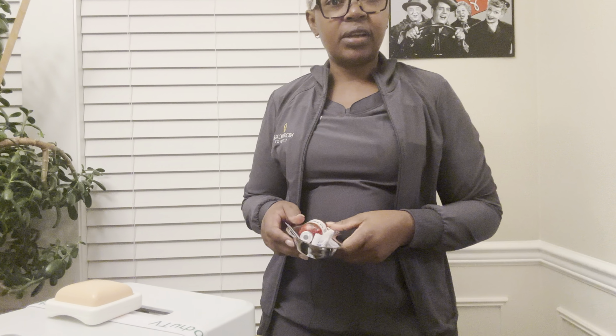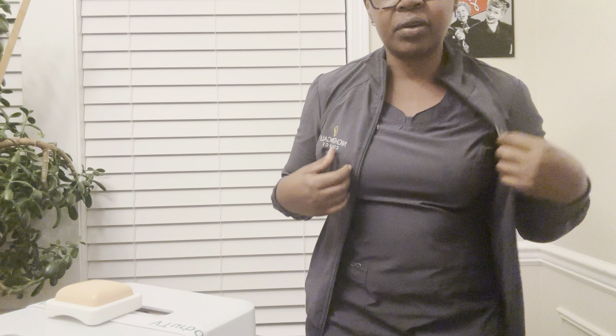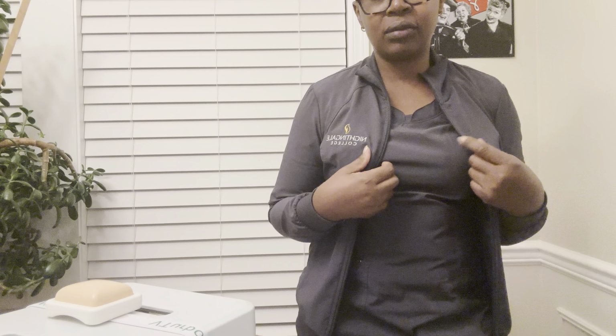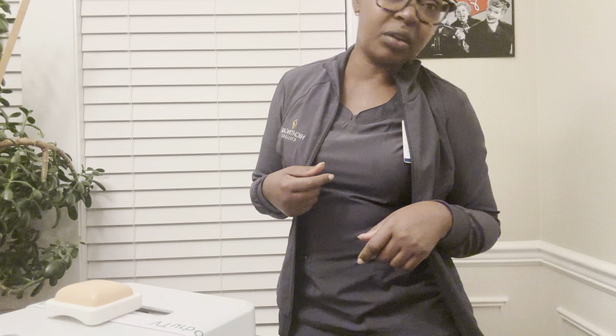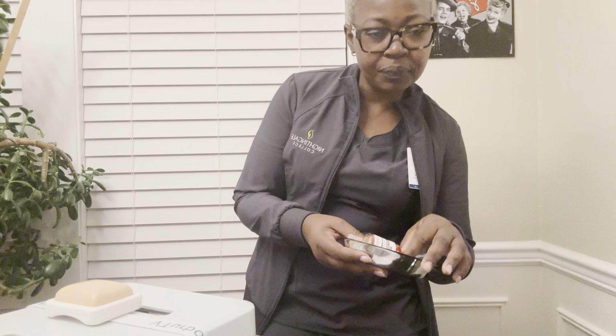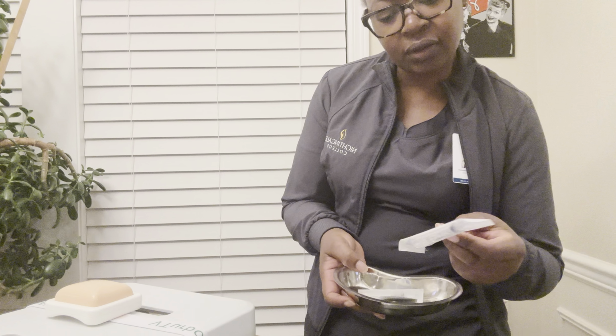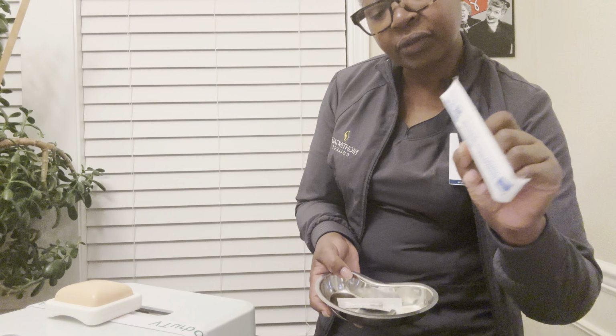I'm here to administer an IM medication, and I'll start by confirming that I have my school uniform, my badge, and the shoes appropriate for the skill. I will be doing an IM injection, and I've gathered my supplies. I have the medication here. I have the syringe, which is a 3 ml syringe.